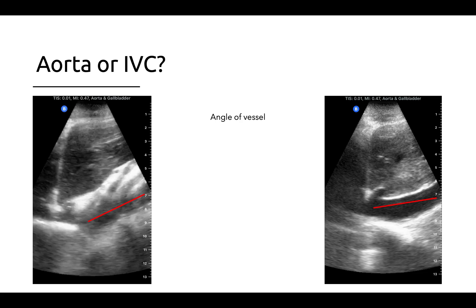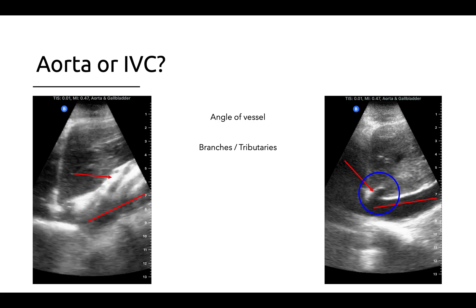A more definitive marker is the presence of branches or tributaries. The aorta has several anterior branches that take off just caudal to the liver, of which the celiac trunk and SMA are visualized here. The IVC, on the other hand, has a single large tributary in this area, which is the common hepatic vein, seen here draining from the liver into the IVC just before the IVC enters the right atrium.